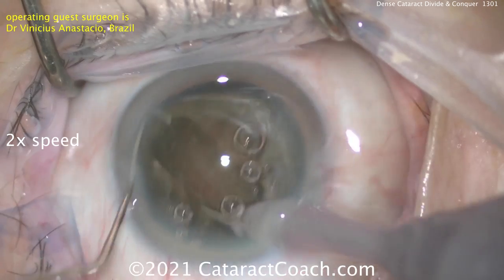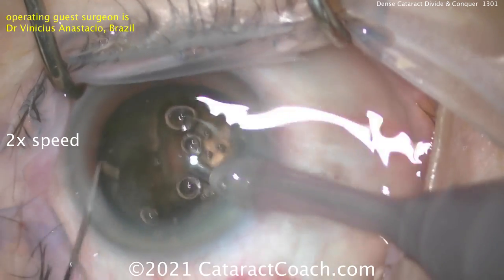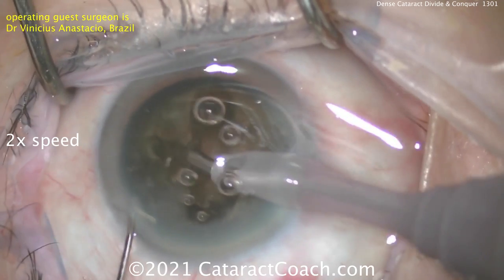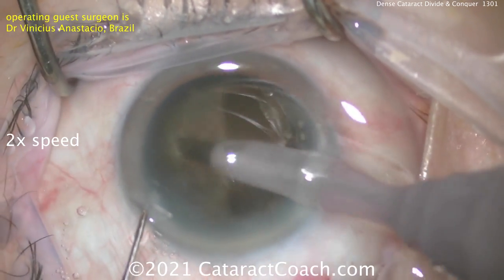Now you've got two heminuclear pieces. These can be grooved again. The divide and conquer is going to divide it one more time — this half is going to be divided into two quadrants.